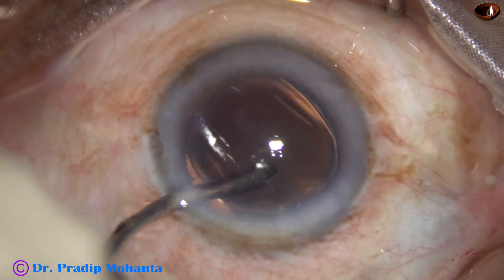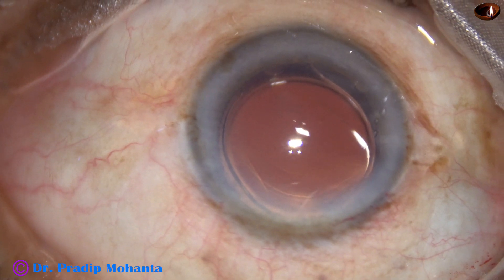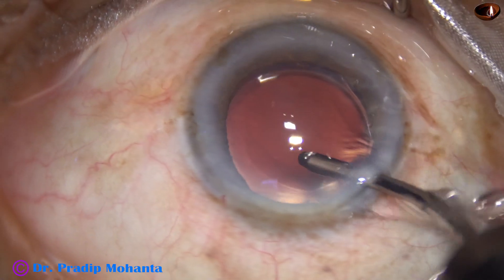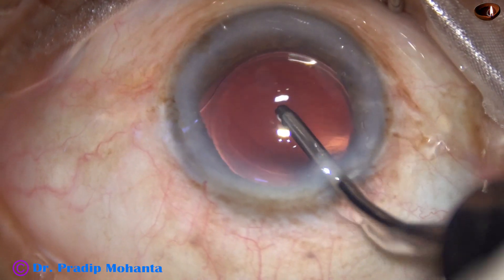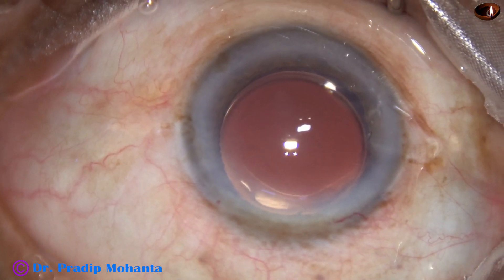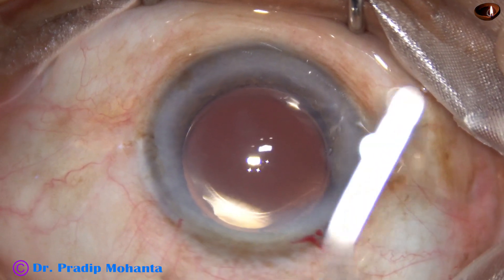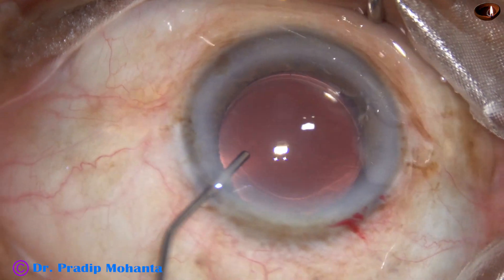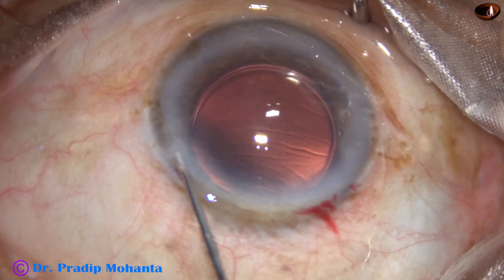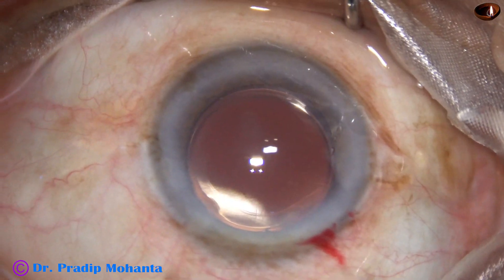Note that just by a gentle push of the irrigating cannula, the trailing haptic goes into the capsular bag. We need not use a Sinskey hook or any other instrument to dial the lens into the capsular bag. Yes, the lens is nicely placed in the capsular bag and we have completed the surgery.